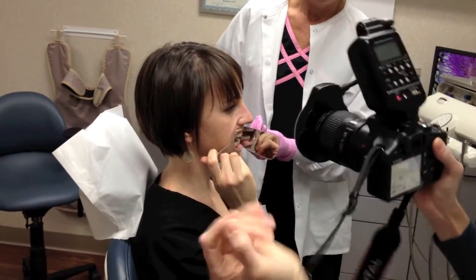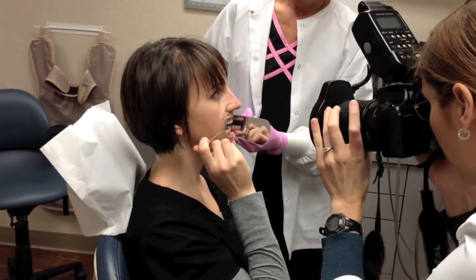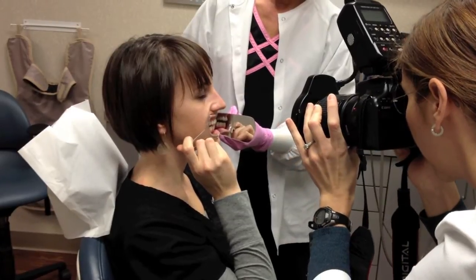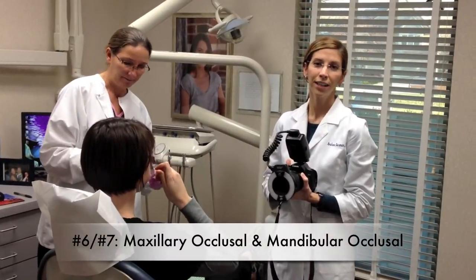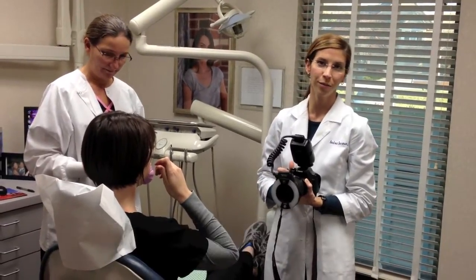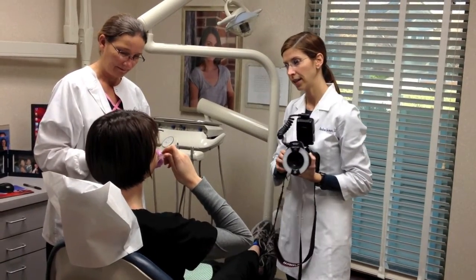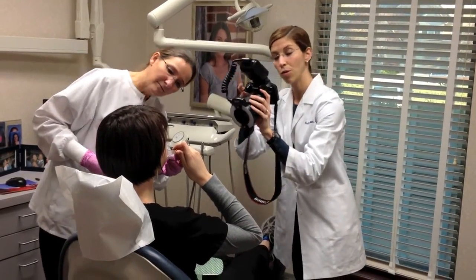My assistant holds that for me. I'm going to take right back just a little bit. I'm going to put your teeth together for me. Finally, I take pictures of the upper and lower arch using a mirror. The patient holds the retractors for the upper one — I'm going to have you hold them out and up slightly. My assistant puts the mirror into place, that's been dipped in warm water.